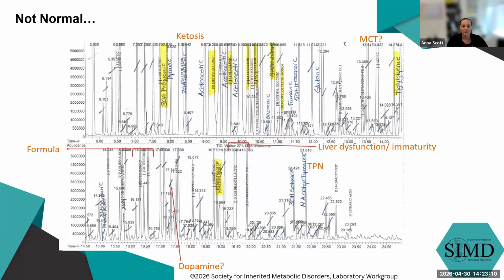And here, all of the slash marks indicate that that was something in this urine sample that was extracted and does not match anything in our library, unable to identify. Probably a combination of endogenous compounds, probably a mix of medications. But in that mess, we've got stuff that tells me a little bit about the clinical status, but we also have all of the yellow highlights point to a specific genetic abnormality.